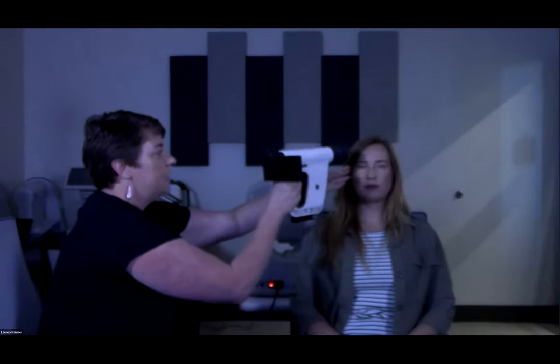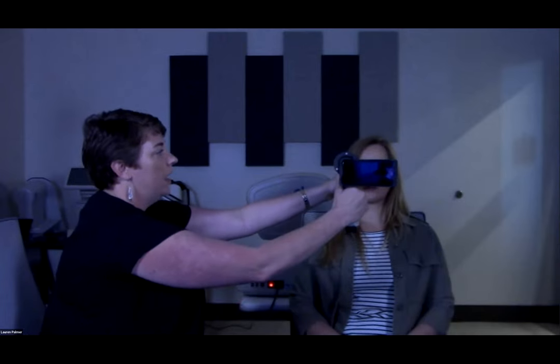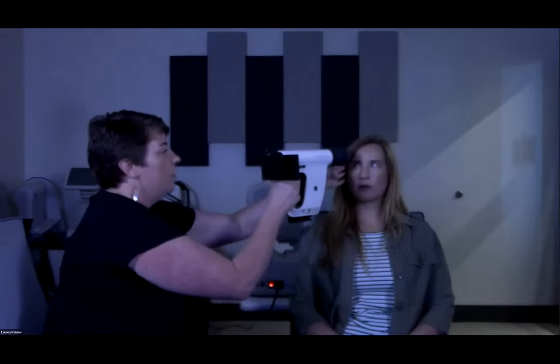So when I place my hand at Rebecca's temple and I land the camera in front of her face, you'll notice I'm not coming straight on. I want to come at about a 30 to 40 degree angle. You can use the corner of the patient's chair as a reference point. And so when you place your hand on their forehead or temple, depending on which hand you're holding the camera in and which eye you're taking a picture of, you land the camera on your thumb.